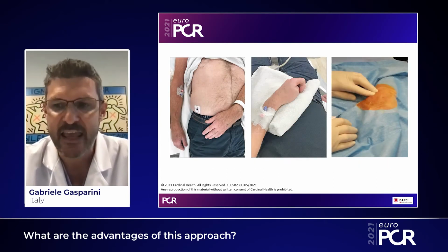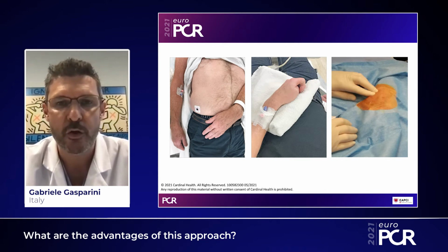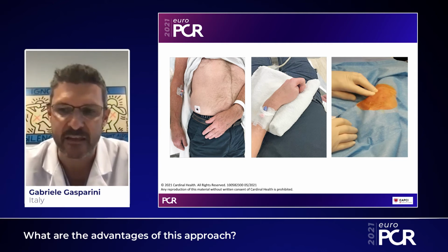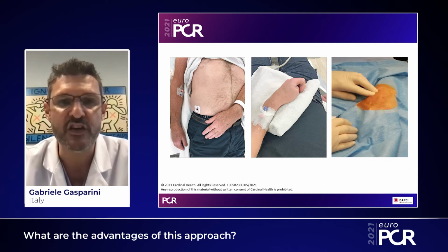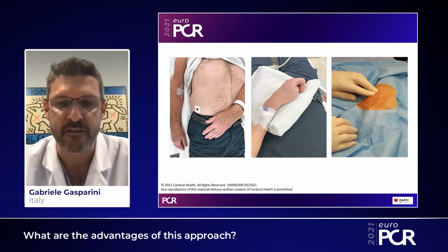Additionally, in case of left distal radial approach, we have the traditional advantages of left approach over the right and specific advantage of left distal radial approach over standard left radial approach, such as patient comfort and operator comfort and safety as well.